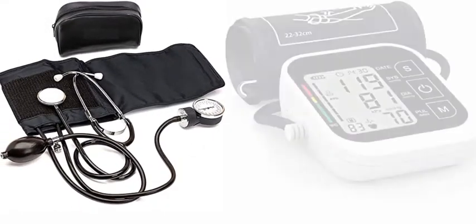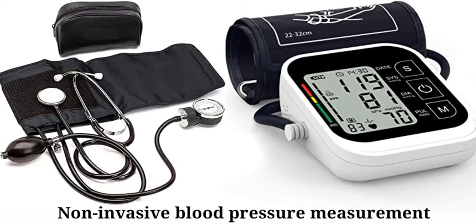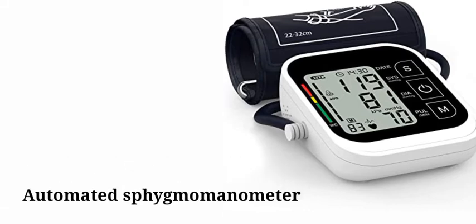Most of us know that the commonest way of measuring blood pressure is by using a BP cuff, which is known as non-invasive blood pressure measurement. The pressure is obtained by using a manual or automated sphygmomanometer. It is called non-invasive because no instruments are introduced into the body. Automated device measures the blood pressure. The pressure is displayed continuously, but the measurement is intermittent.